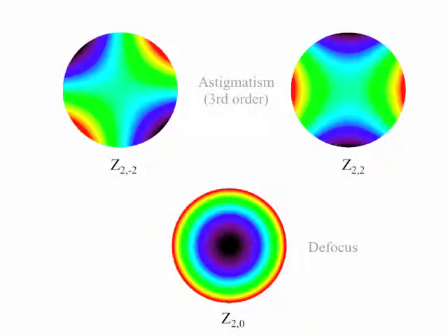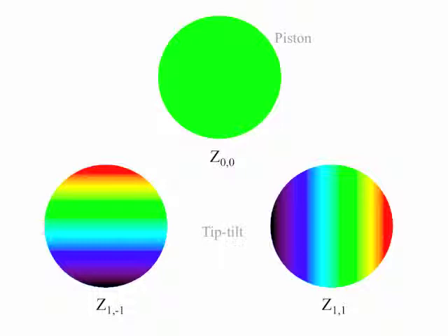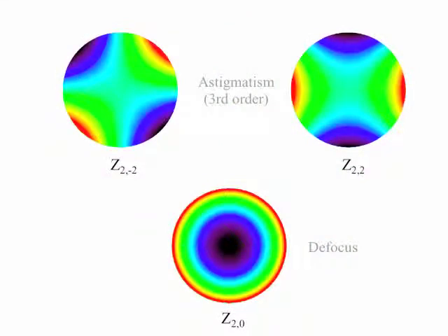Now, when we get to third order Zernike polynomials, let me just go back one step, because I want to make things every bit as confusing as they really are. A first degree Zernike polynomial is written with a subscript of 0. So the subscript is always kind of n minus 1. So piston is a first degree Zernike polynomial. Tip tilt is a second degree Zernike polynomial. All of the stuff that we are interested in clinically are third-degree Zernike polynomials.